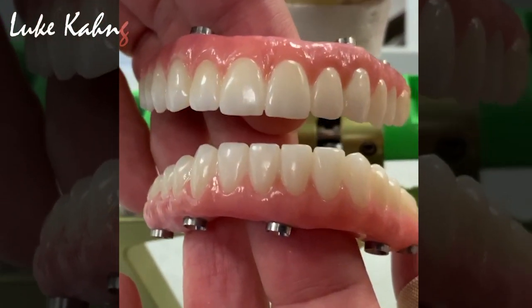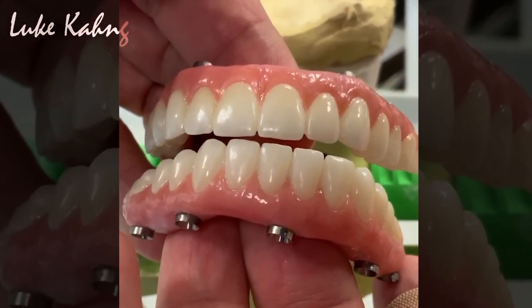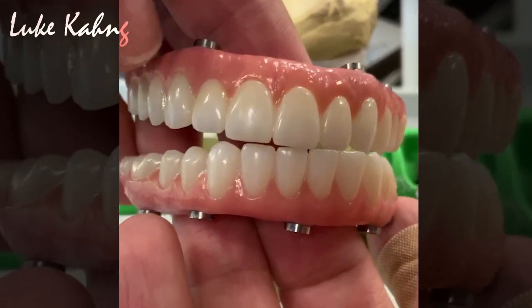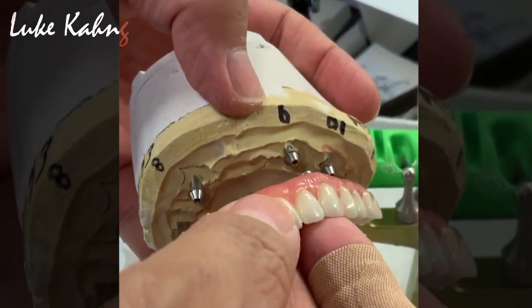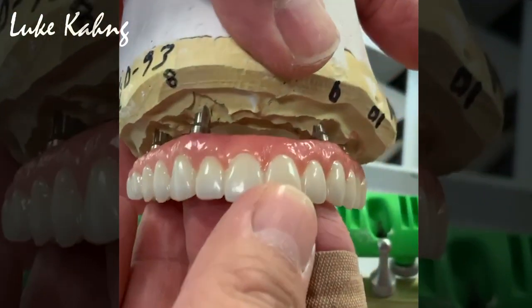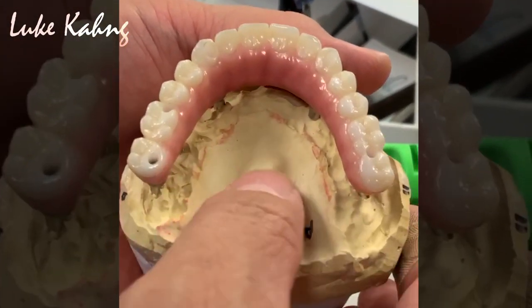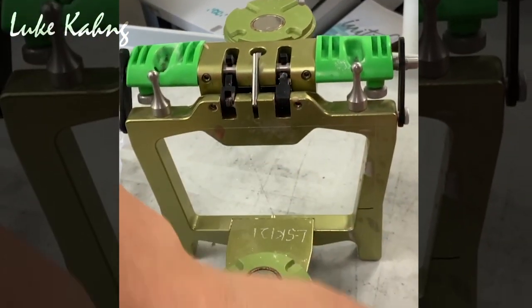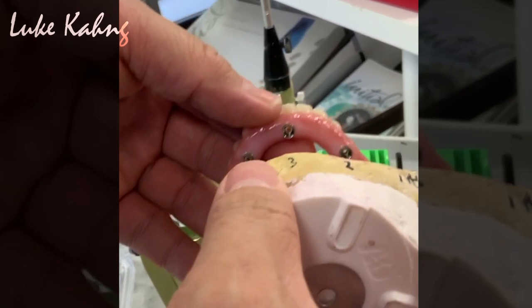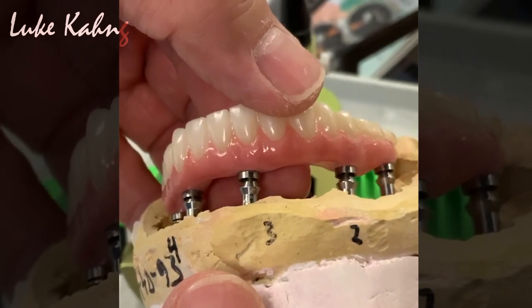So the finish is monolithic. Okay. So we made a great anatomy, the contours, everything. Okay. So here is the. Just make sure to all the way fit it. That's so good. That's great. And then lower. Just like the glove, like fitting.